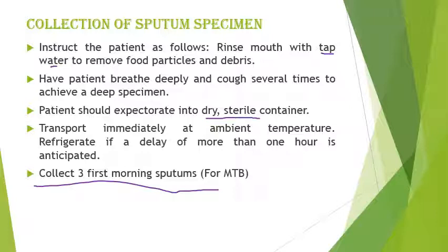So, if you will be doing an induced sputum collection, 15% sodium chloride and 10% glycerine, approximately 10 minutes or until the strong cough reflex is initiated. So, the 15% sodium chloride, or your salt, and the 10% glycerine are used to induce the sputum sample.